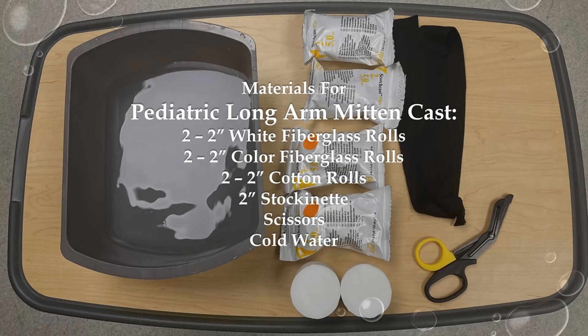The positioning for the long arm mitten cast is with the forearm in neutral position, with the elbow at 90 degrees and slight 10 to 20 degrees extension of the wrist. Remember to make sure the fingers are flat and not overlapping. After you are done, clean your area and discard the water.